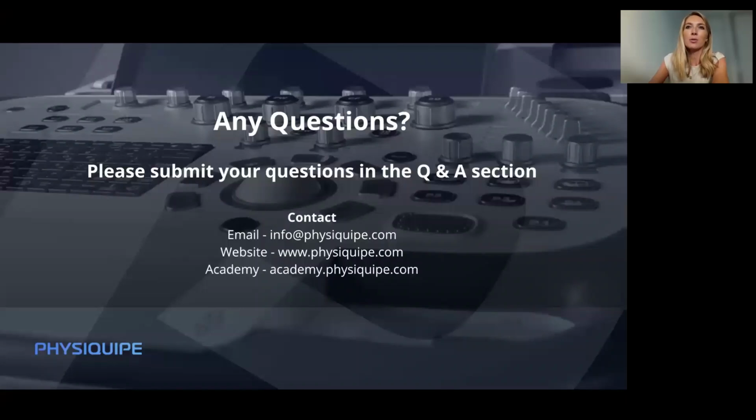So how often would you be using diagnostic ultrasound in monitoring healing or progression in chronic overuse conditions? Are there any limitations as well with that? Yeah, absolutely. Actually, I'll answer that question backwards. So the limitations really are firstly the fact that it's user dependent. The better you get, when you see someone who's fantastic at ultrasound, you can see how good and how easy they make it look and how good the images you can get. And then obviously that depends on a few other factors, including the machine and your experience with it. But I think that's the biggest limitation really, in terms of actually getting good images and monitoring rehab.